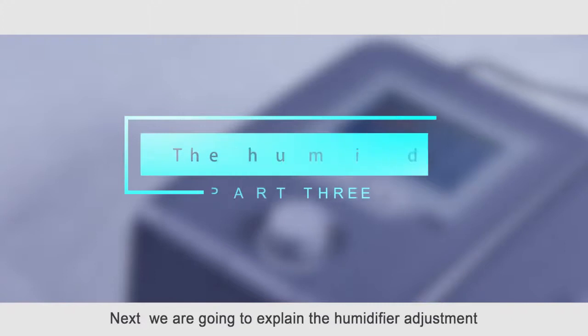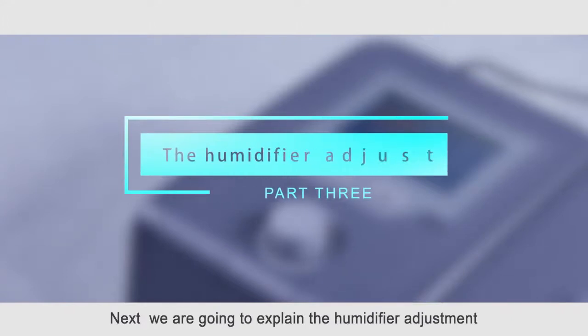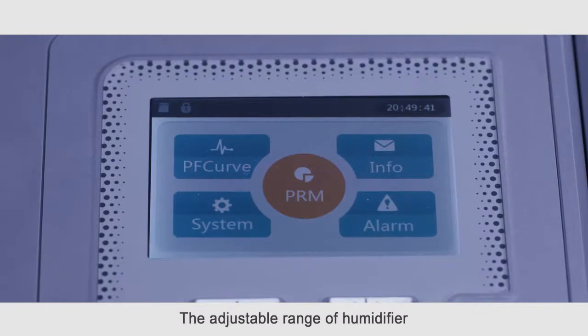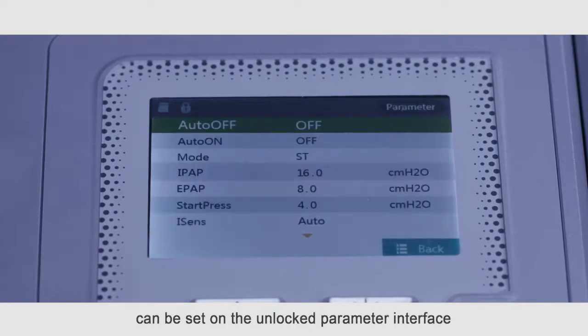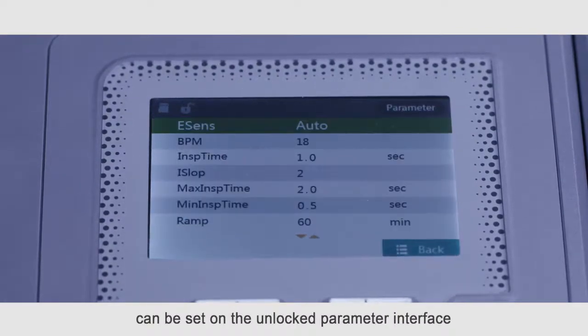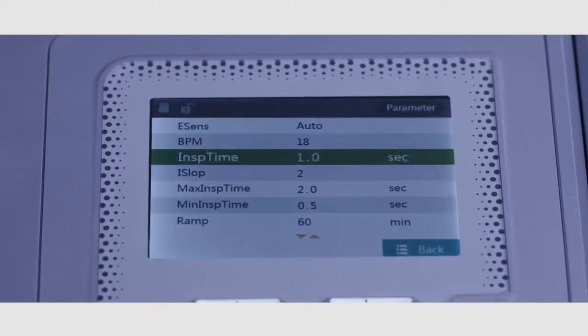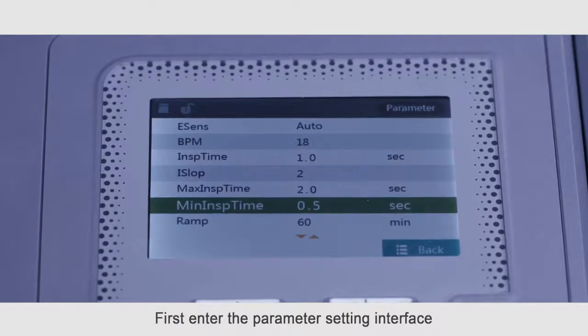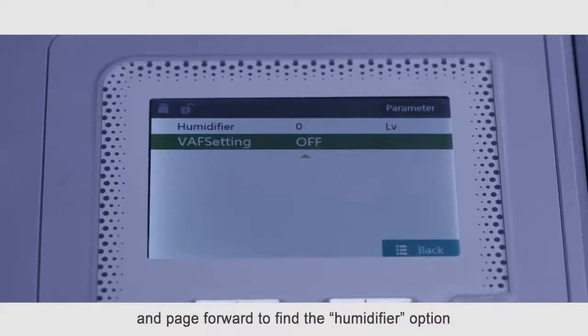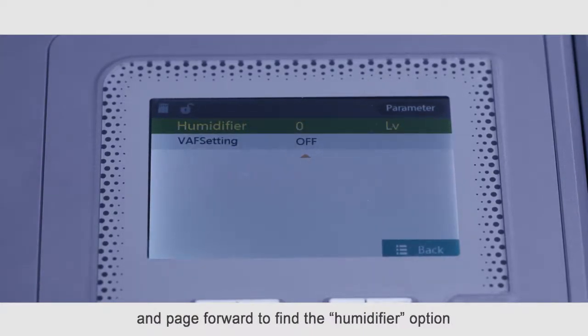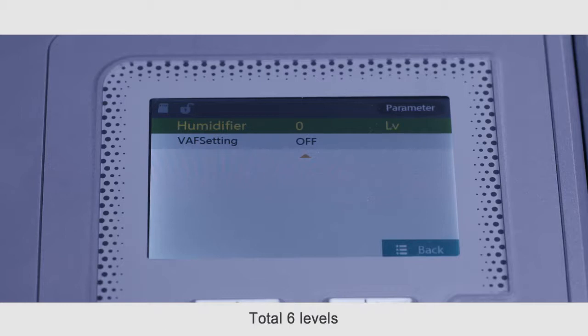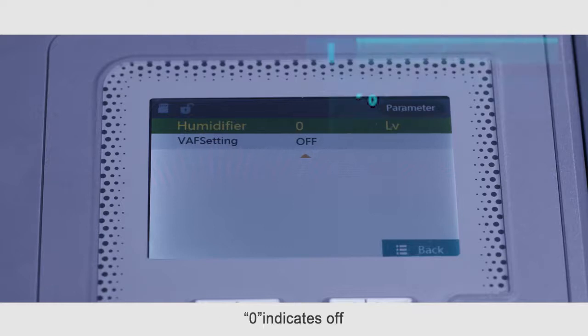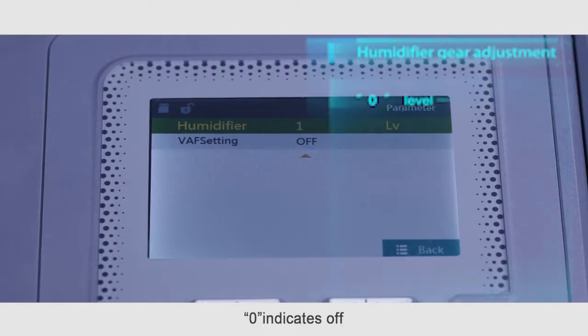Next, we are going to explain the humidifier adjustment. The adjustable range of humidifier can be set on the unlocked parameter interface. First, enter the parameter setting interface and page forward to find the humidifier option. Total six levels. The higher the setting value, the higher the humidity. Zero indicates off.